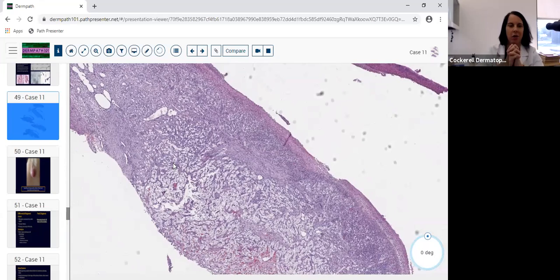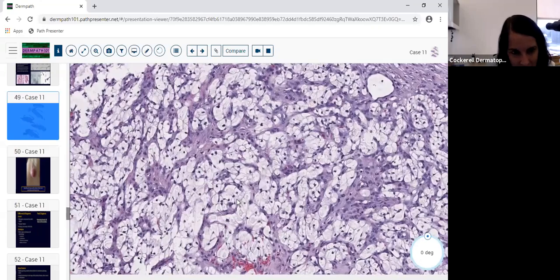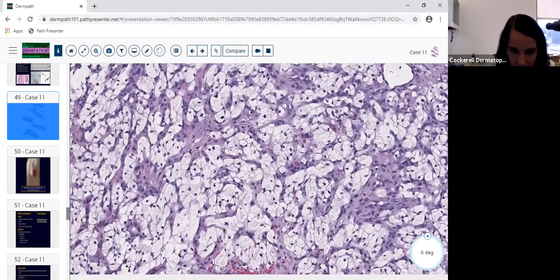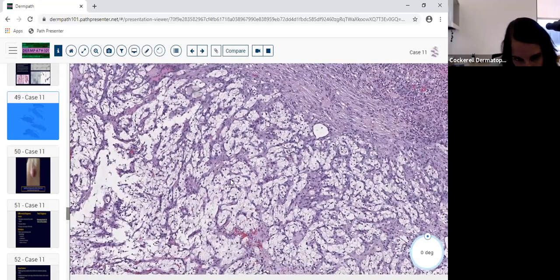So with sebaceous carcinoma, you'll see more basaloid areas, especially with this degree of invasion and this degree of tumor involvement of the tissue. Usually with sebaceous carcinoma, you'll see more basaloid areas, and then sebaceous differentiation. And you can put some stains on this. I mean, the PAS will be negative with the sebaceous carcinoma. It'll be positive here. It's diastase labile.